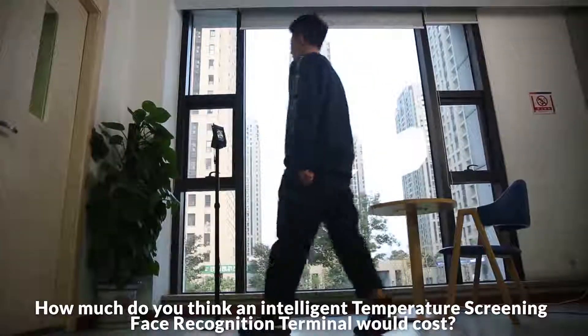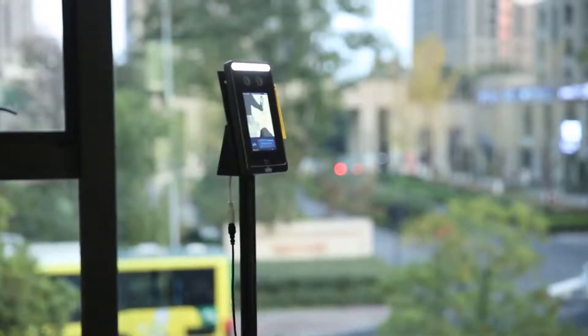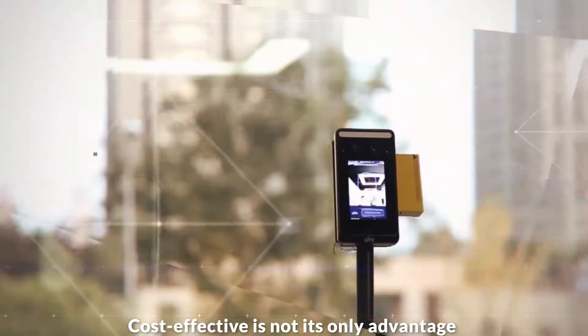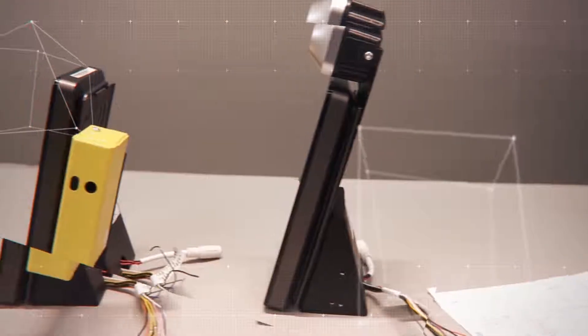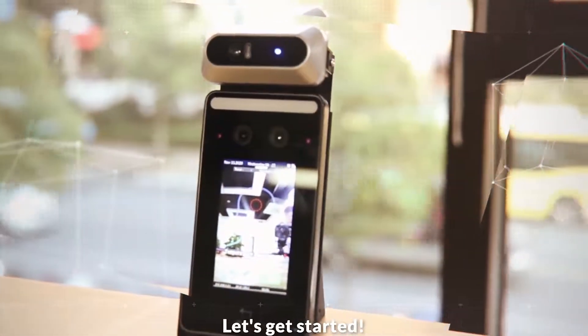How much do you think an intelligent temperature screening face recognition terminal would cost? What if I tell you it's even cheaper than your imagination? Cost effective isn't its only advantage. Want to know more? Let's get started.